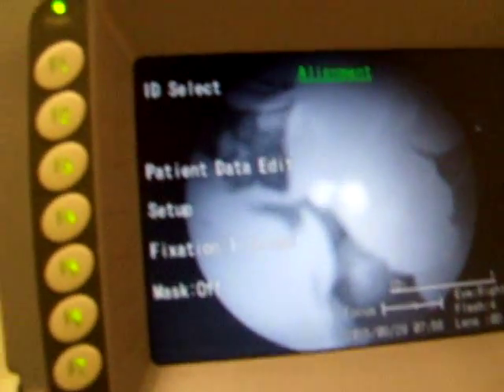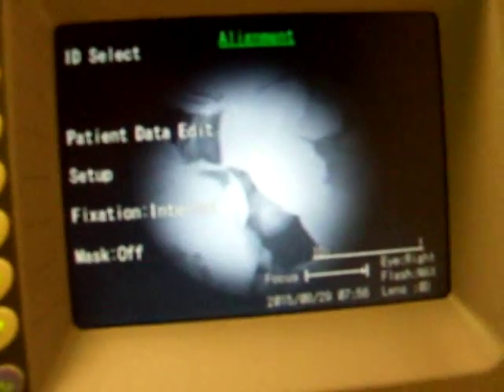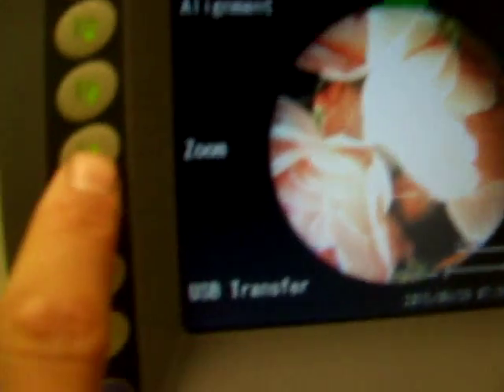Now let's focus it. You can see the two focusing marks — line them up so they're straight, using the little joystick and the knob. I'll set the flash to max and then I'll take the picture. There you are. Very nice. You can zoom on it and move the little crosshairs to select an area to zoom in. Zoom in — very nice.